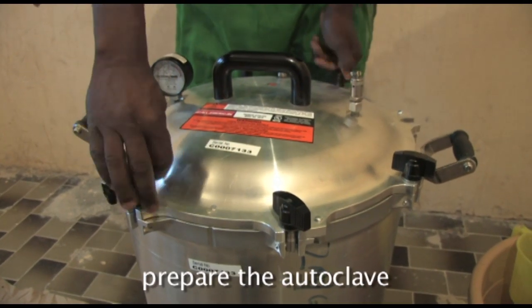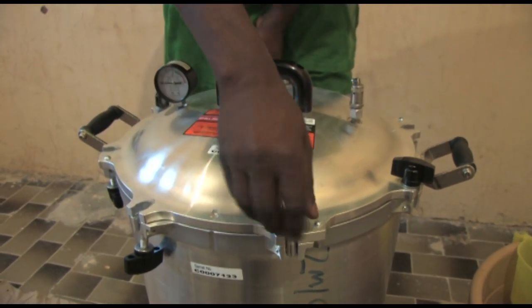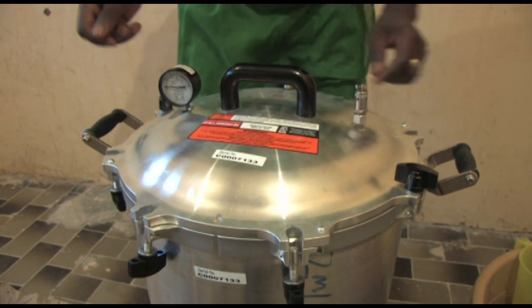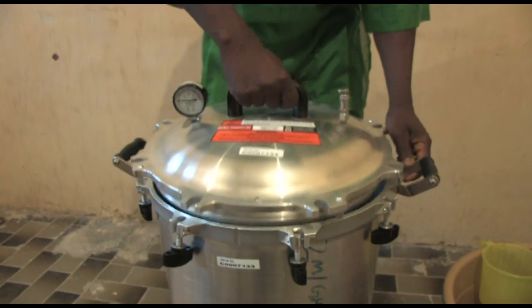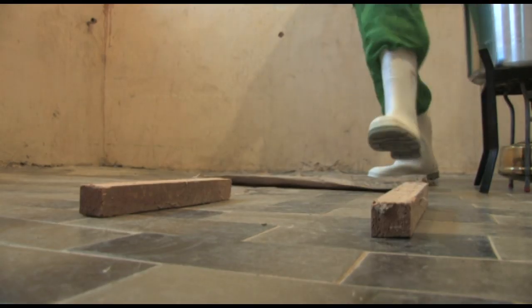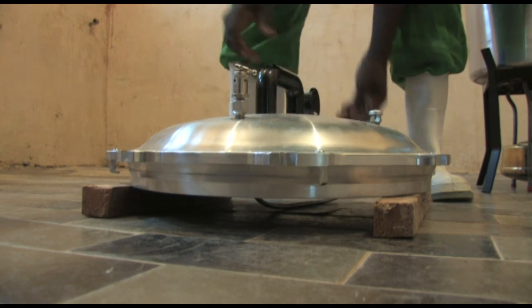First, open the lid by turning the Bakelite wingnuts in a counterclockwise motion. Always undo two opposite wingnuts at the same time. Turn the lid counterclockwise and then lift the lid. Place it on wooden blocks to prevent the air vent pipe being damaged.